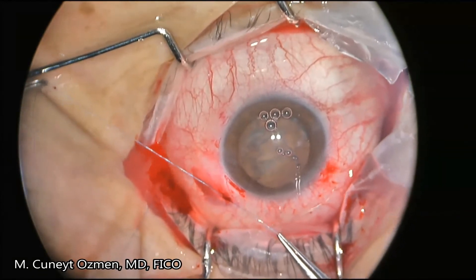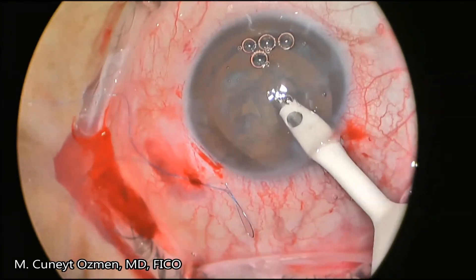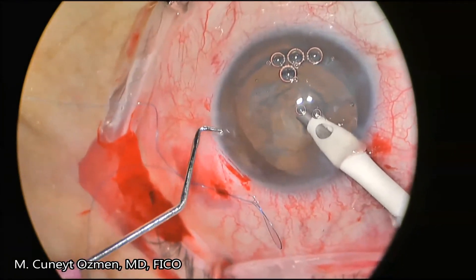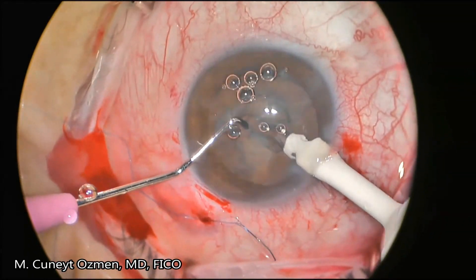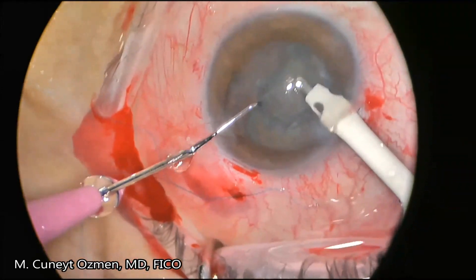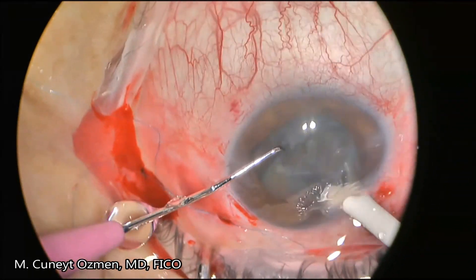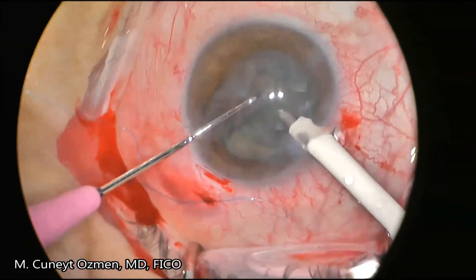Now we have a centralized and stabilized lens-capsule complex and we can move forward with phacoemulsification safely. Even though the patient was a 50-year-old male, the nuclear material was very soft and we can extract the nuclear and epinuclear material with flip techniques.